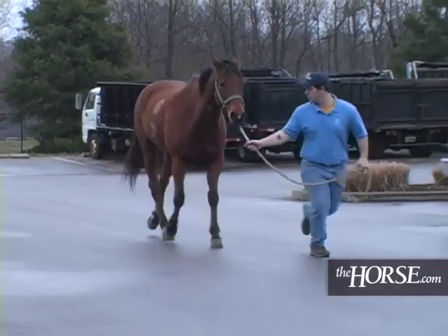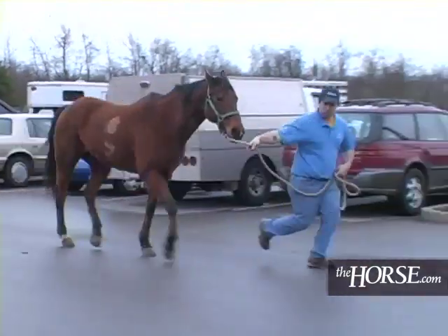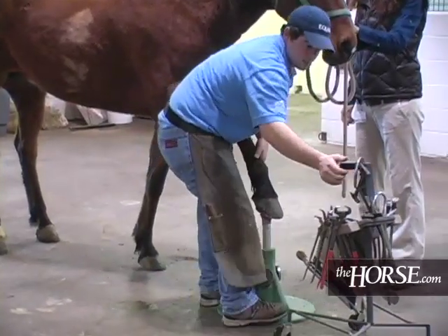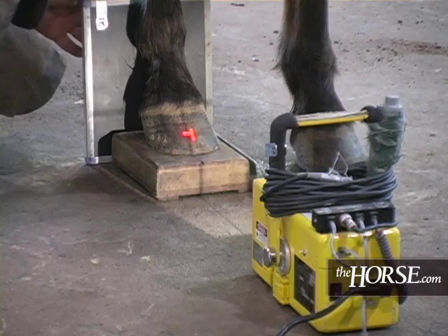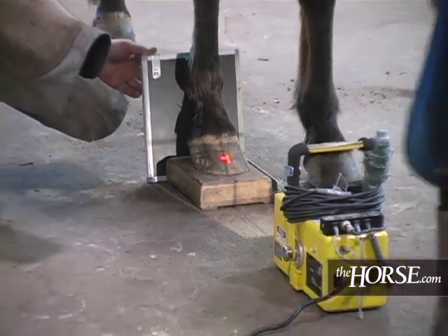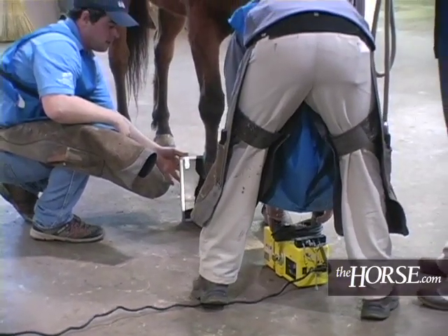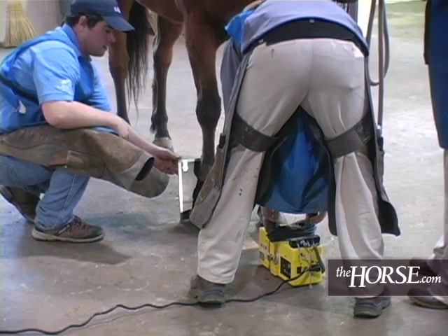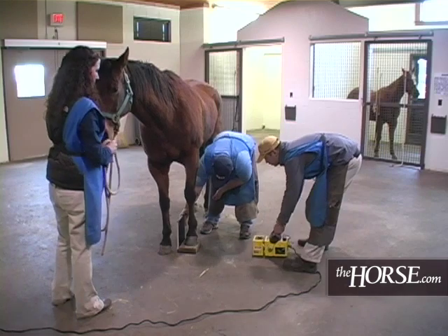After the ab-axial nerve block on the right front, we got about 80% resolution of the lameness. So we're going to go ahead and pull the shoes and take radiographs and see what kind of pathology is there. It's really important when you're going to take foot films to clean up the foot and make sure there's no dirt, rocks, or any kind of debris around the frog that can cause you to misinterpret your radiographs — you've got to make sure they're really clean.